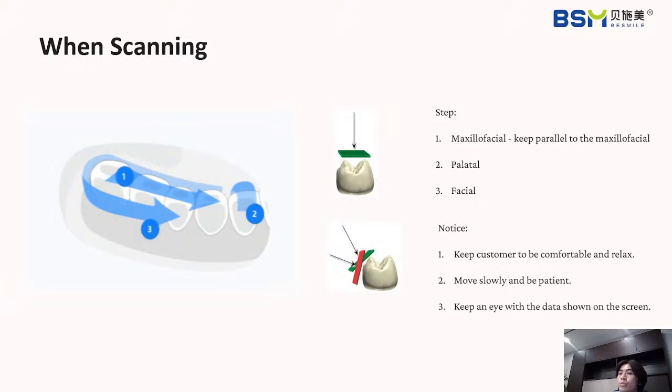When you do this scanning, please be sure to keep your customer comfortable and relaxed, to let them be more cooperative. Also, please move the scanner slowly and keep an eye on the data shown on the screen to improve the data acquisition.